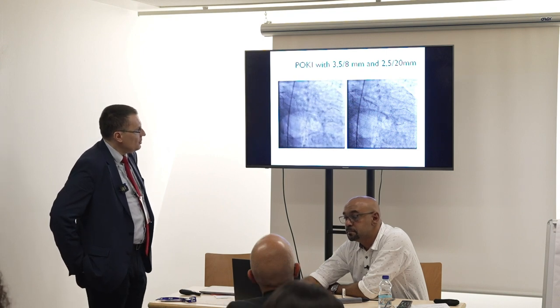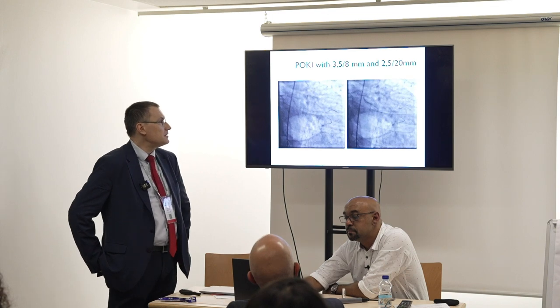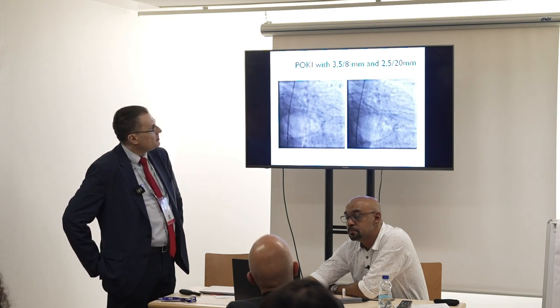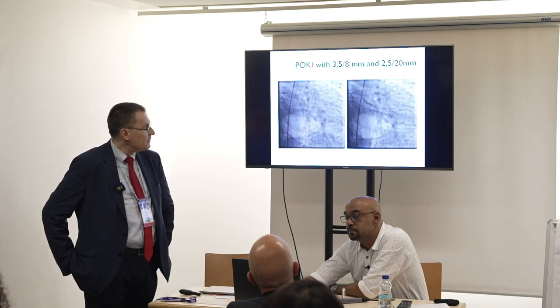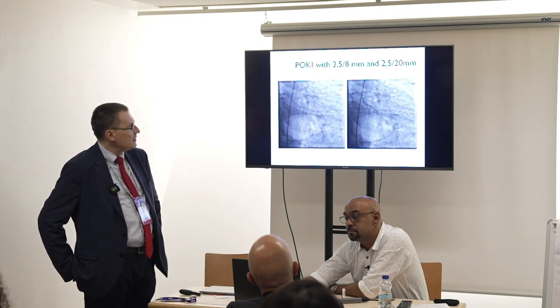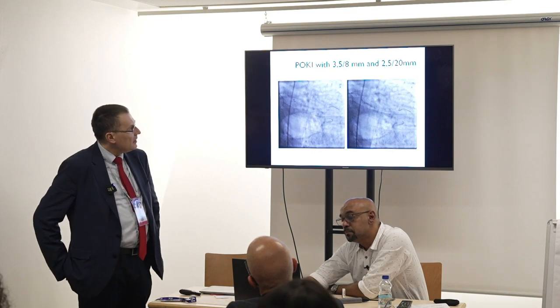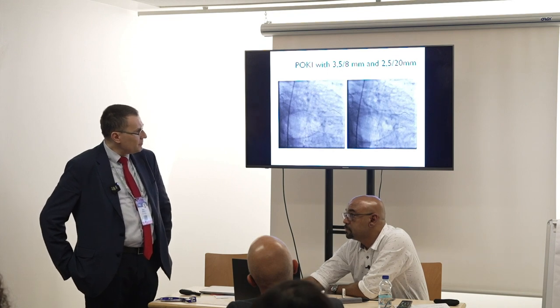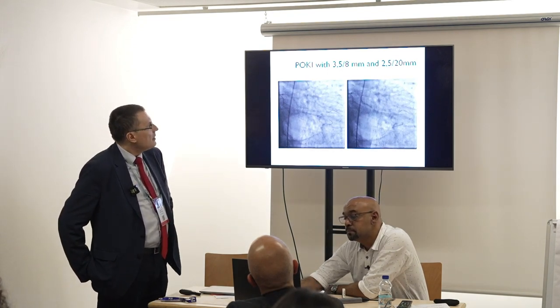This is how we do at the moment modification of POT and kissing. We published this last year in Cardiology Journal, the proximal optimization with kissing inflation technique. It requires a 7 French guide with 2 non-compliant balloons and positioning of the POT balloon and side branch balloon inside the ostium of the diagonal.